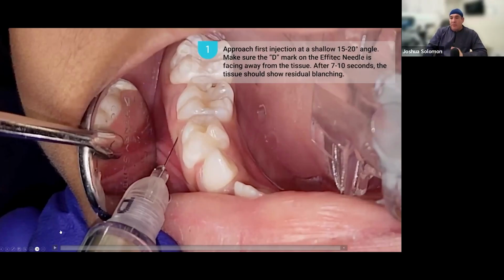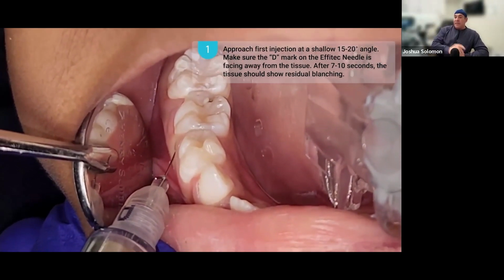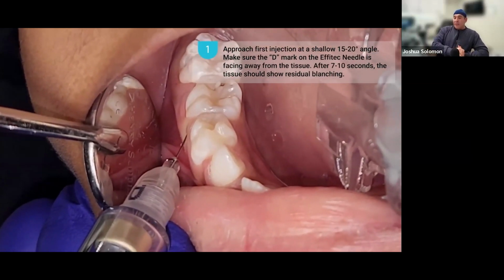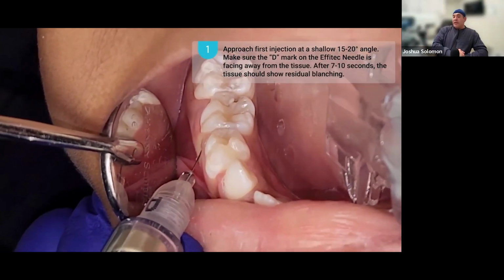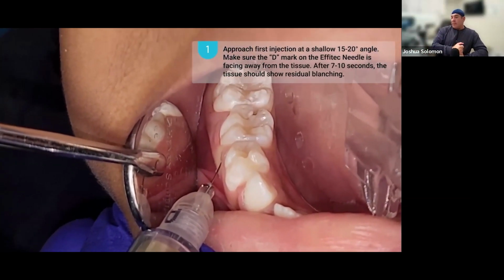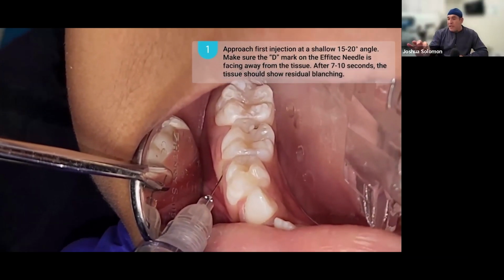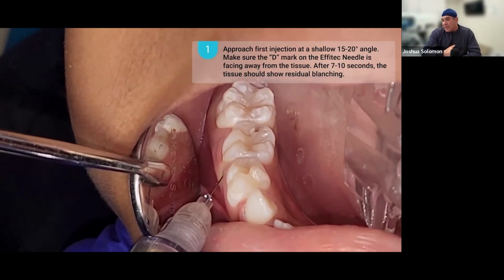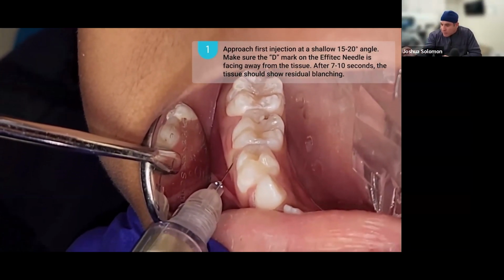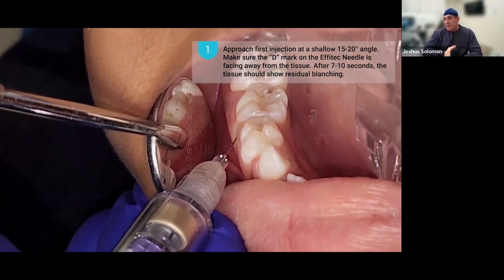This is a great video shot by Paul Bond. I want to just play this for you, and then we'll talk about it in a minute. So this is our stage one. We're entering at about 15 degrees. You notice the D on the needle, it's facing out. And we're delivering enough local anesthetic here to ensure about a 4 millimeter diameter circle, but we want to see blanching. If we have enough blanching there, and this takes, I would say, anywhere from 5 to 10 seconds. If I've got profuse blanching just in that area around the needle, I know I'm able to move to my next step.